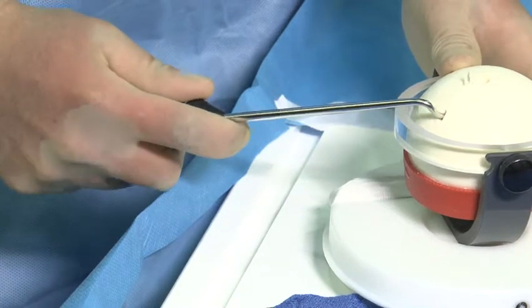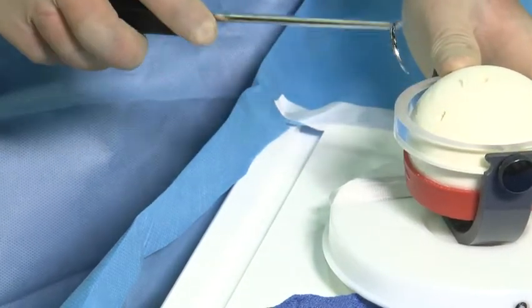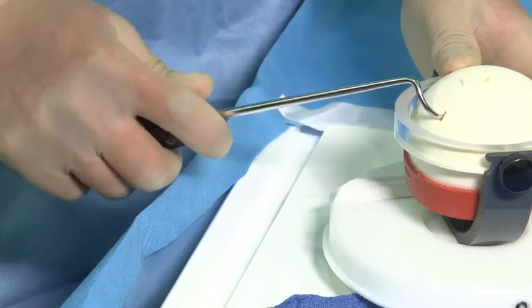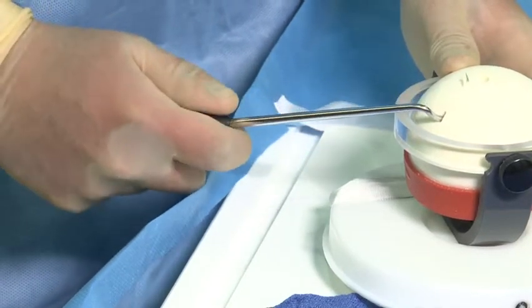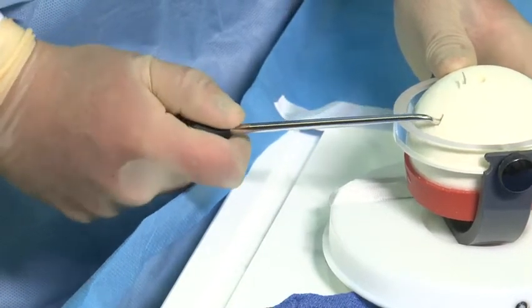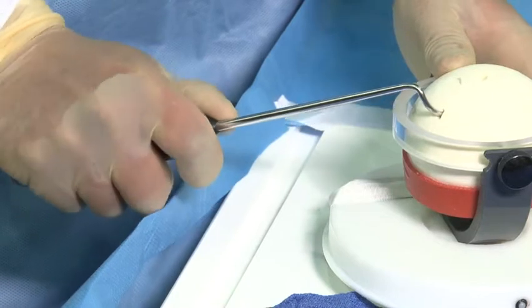The hook is passed into the bone with a slight twisting motion. As it twists through it can be either tapped with a mallet or manually passed, and the tunnel is chamfered with a small twisting motion.